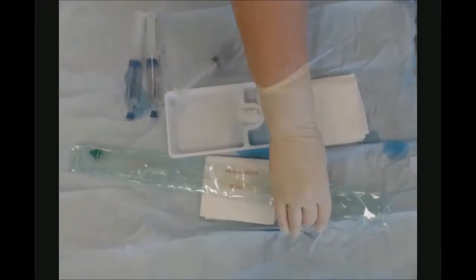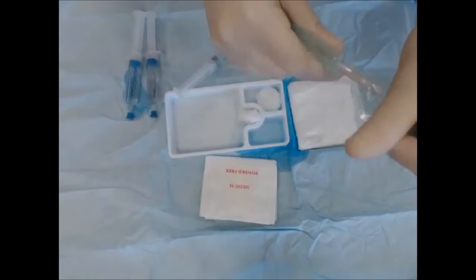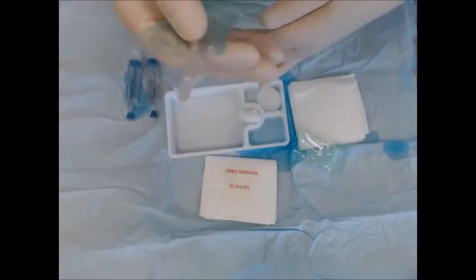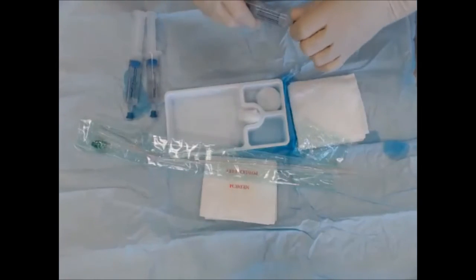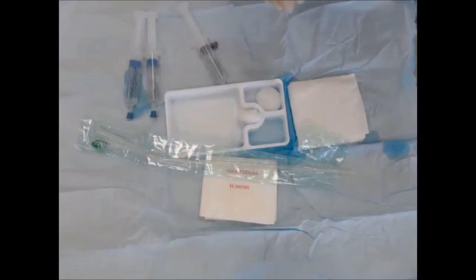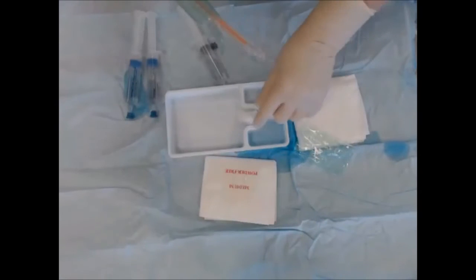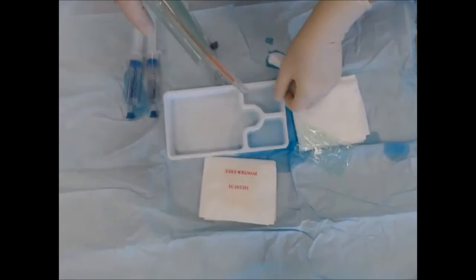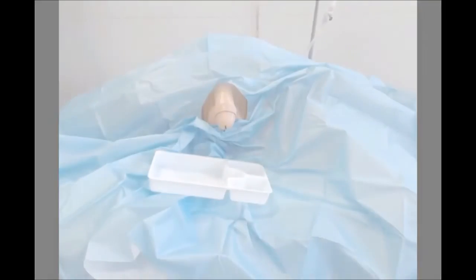During that one to two minutes, get yourself ready. Open the catheter pack so that the tip is exposed, make sure you have water to inflate the balloon, and do another check to make sure your bag is close by. The urine is going to come out reasonably quickly, so it's helpful to take the little tray from the catheter pack and place it underneath.